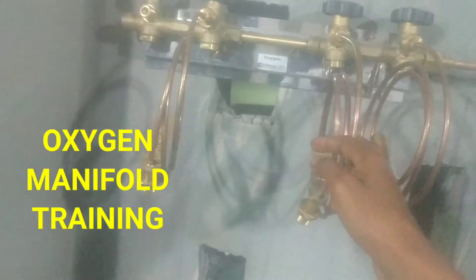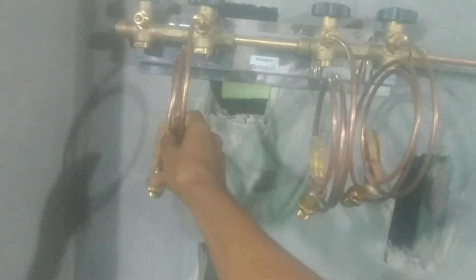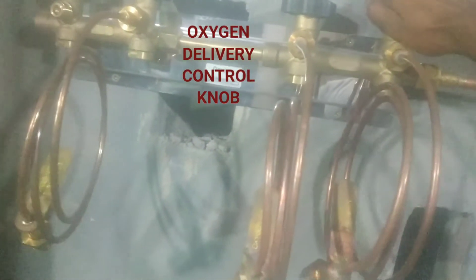These are the bottle connectors — the connectors that are connected to the oxygen cylinders. We connect these connectors to the oxygen cylinders, and then you open these parts for the oxygen to be transferred into the building.